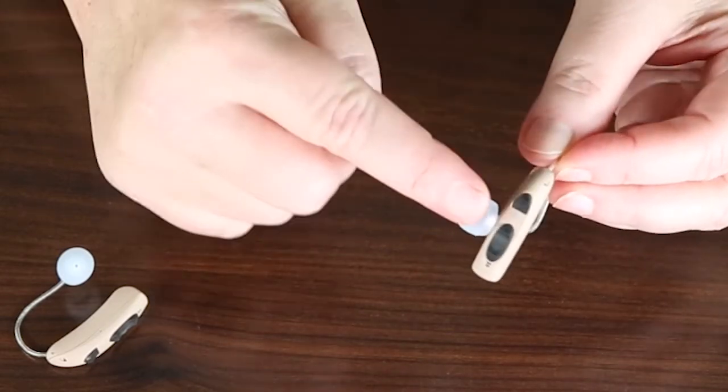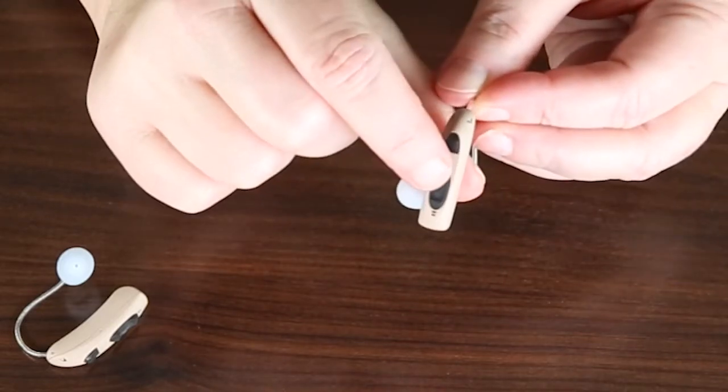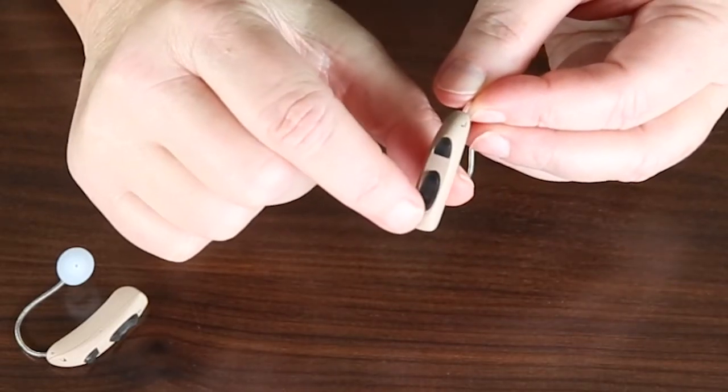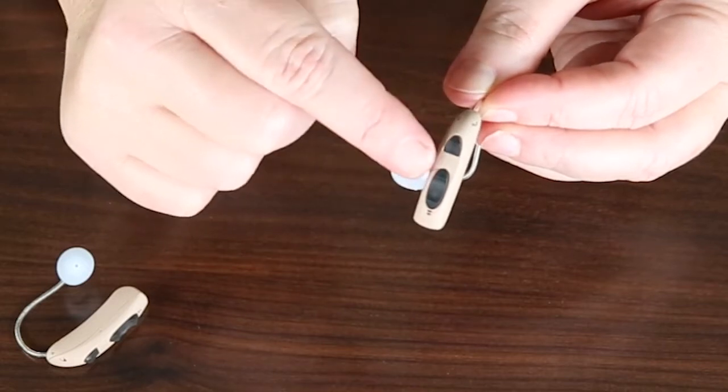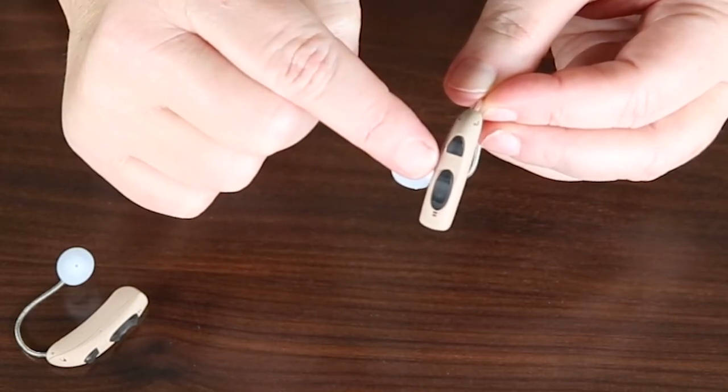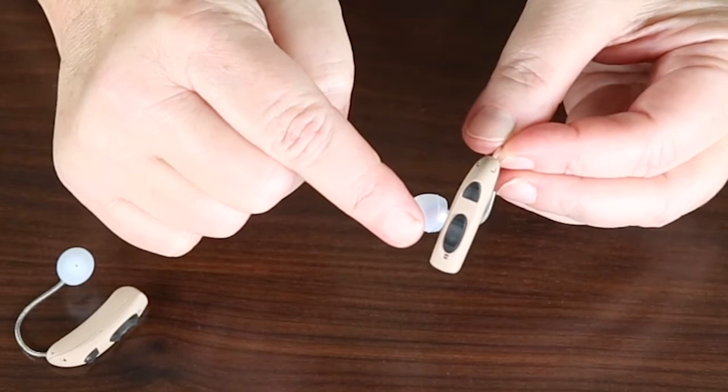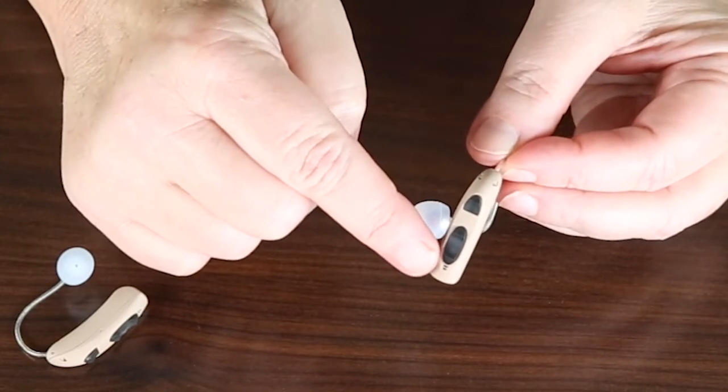Once you have the hearing aid in your ear, you can choose to turn the volume up or down. If you need it louder, you're going to press at the top of the volume button. If you need it softer, press at the bottom of the volume button.